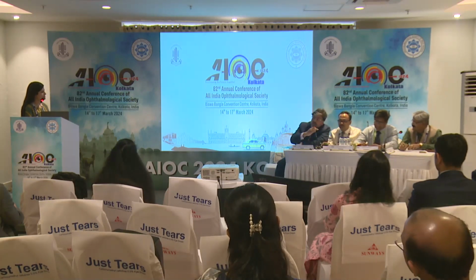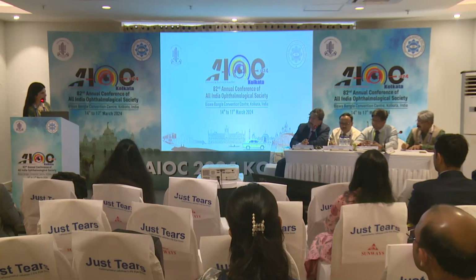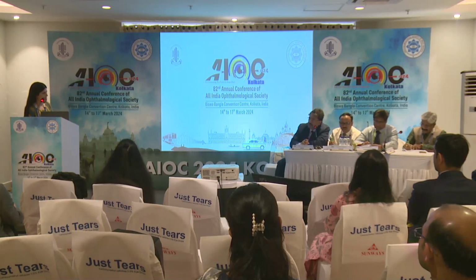Thank you. What was the white to white length of the patient? Because this appeared to be quite an adult child. This was a 4-year-old child. Was it normal, 11.5? Normal. Yes. So you implanted a normal IOL of normal size.